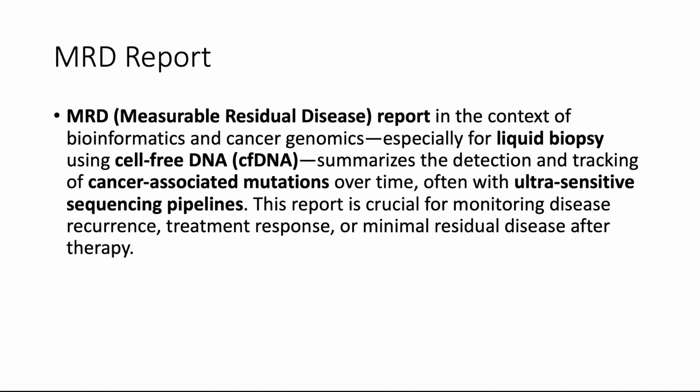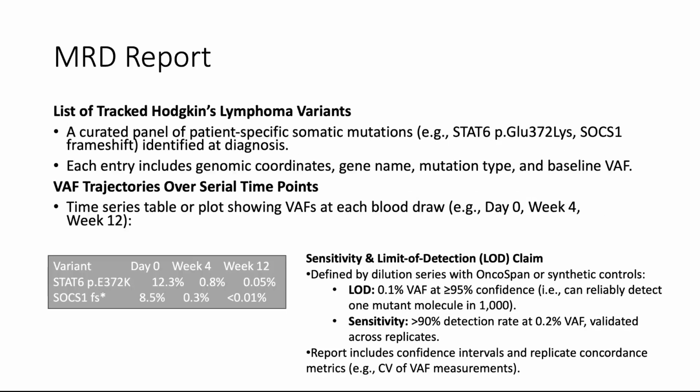In residual disease monitoring, we will need to associate these detected variants with certain time points, and this will be stated in our report, how these variants are connected with the certain stages of the monitoring process. For example, such a report could look like this.